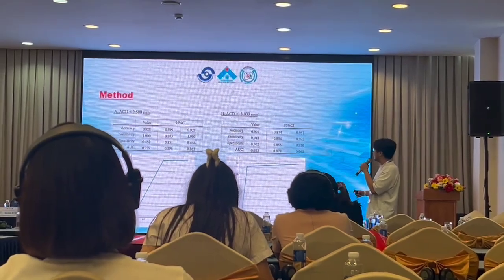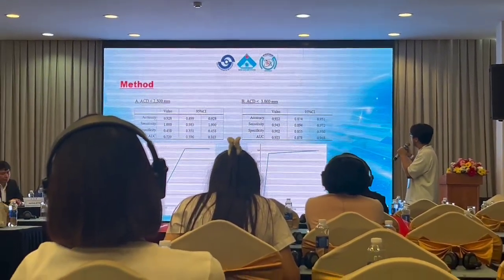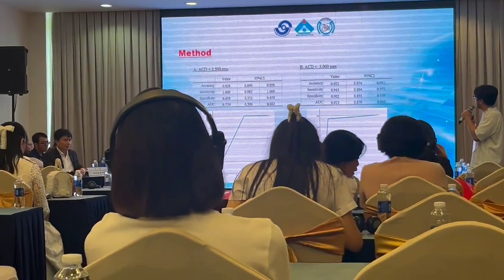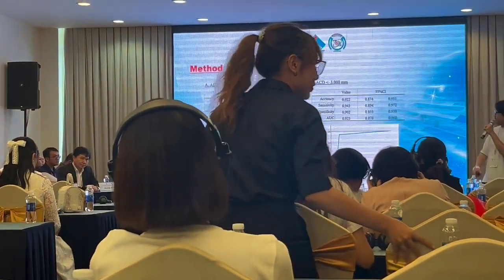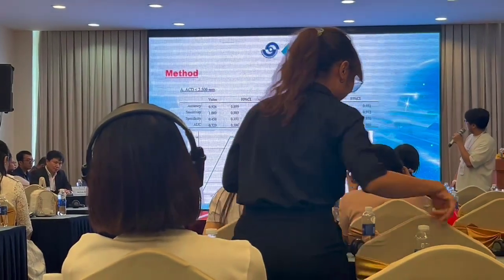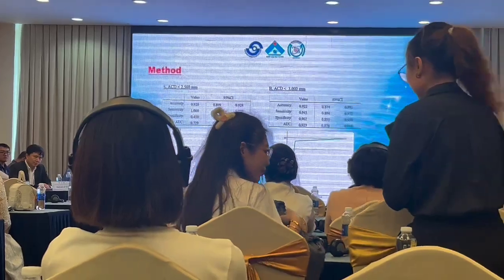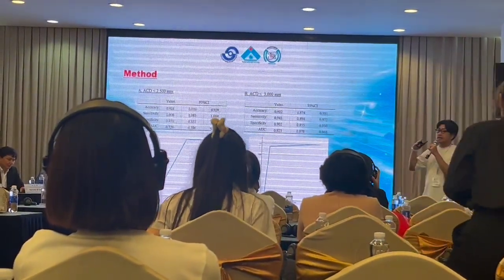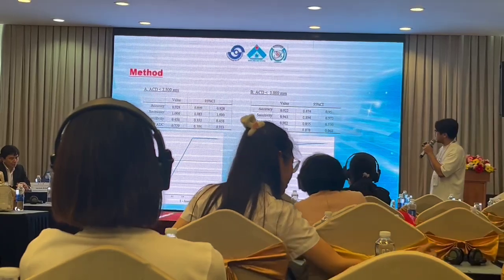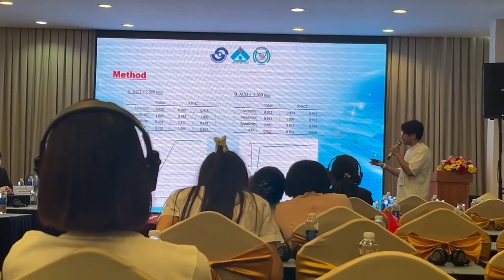When it comes to 3.0, sensitivity is 94% and specificity 90%. This result is pretty hard for us to interpret because things are all divided, and I believe the risk cutoff of the anterior chamber depth differs according to races, countries, and circumstances.